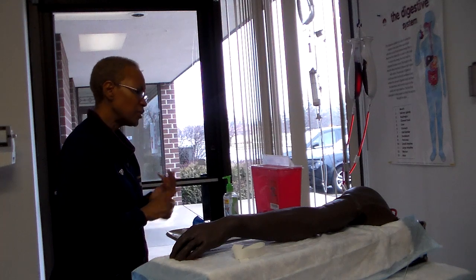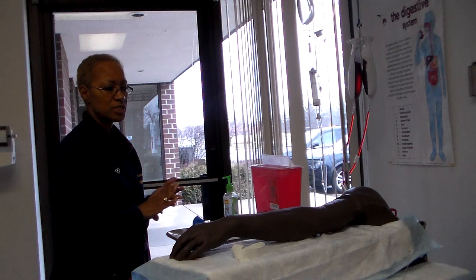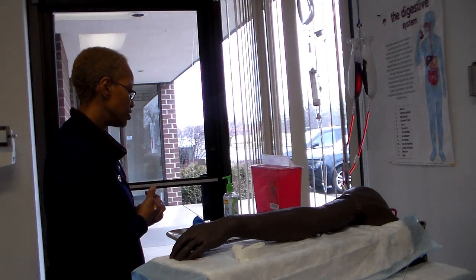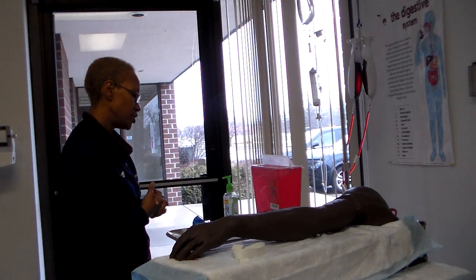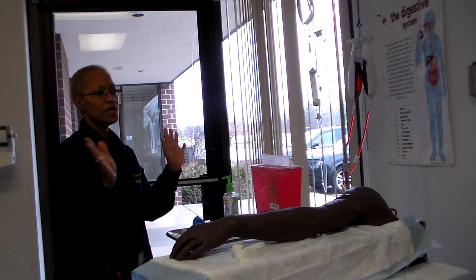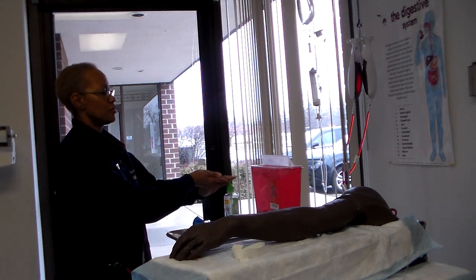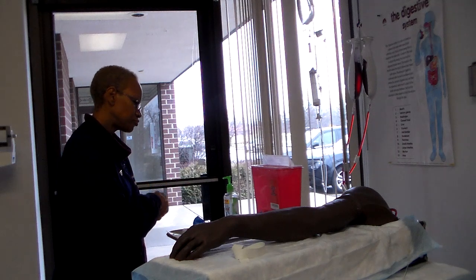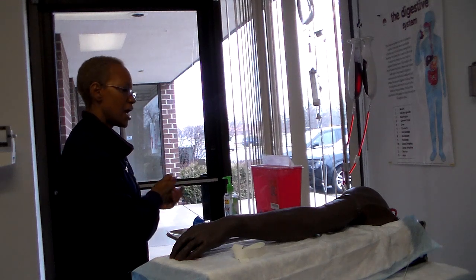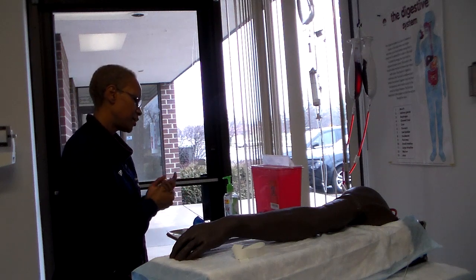Okay. We're going to check their labs. We're going to check them for any allergies. See if they have a latex allergy or any medication allergy, any iodine allergy if you're going to be using iodine, anything like that. And then you're going to go in and explain, of course, do your standard steps. You're going to wash your hands, ID your client, educate them on what you're doing.